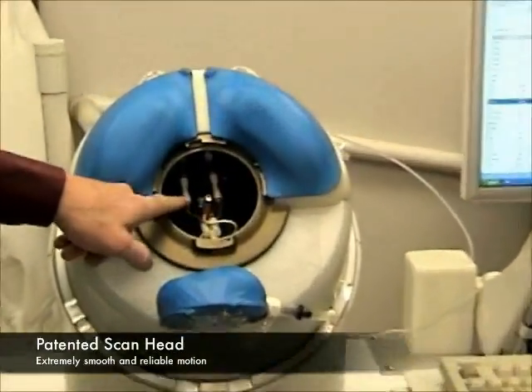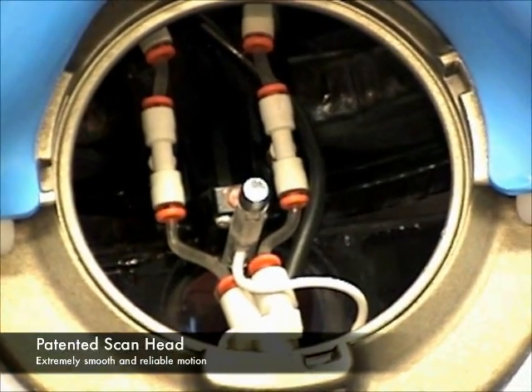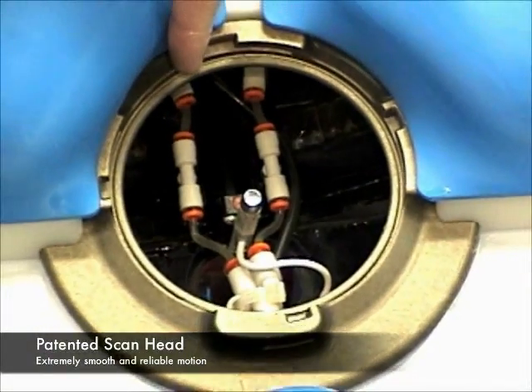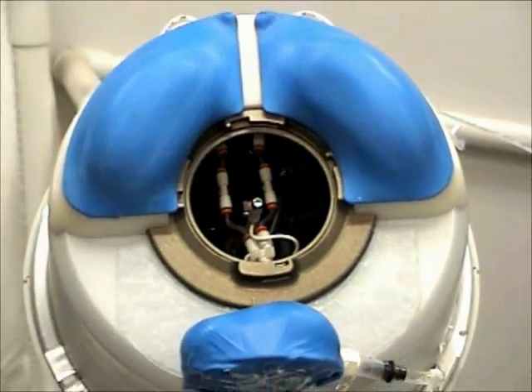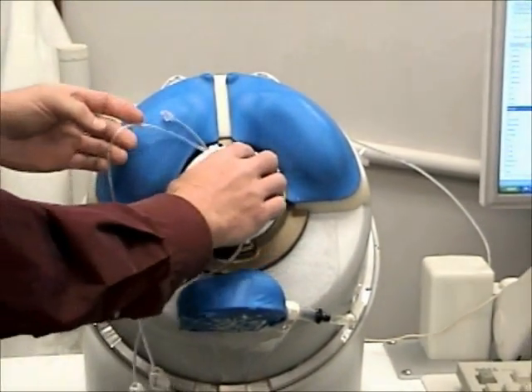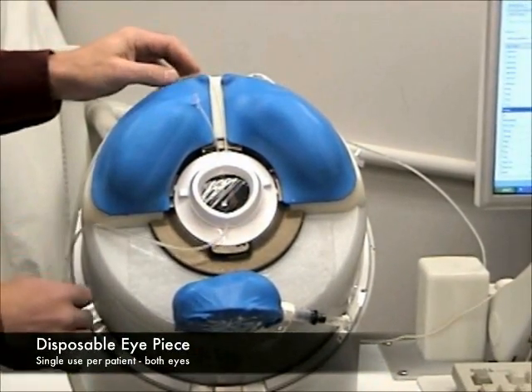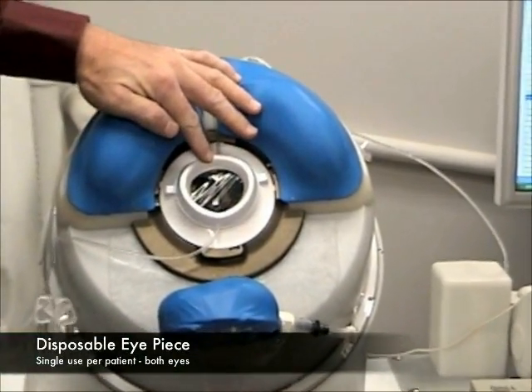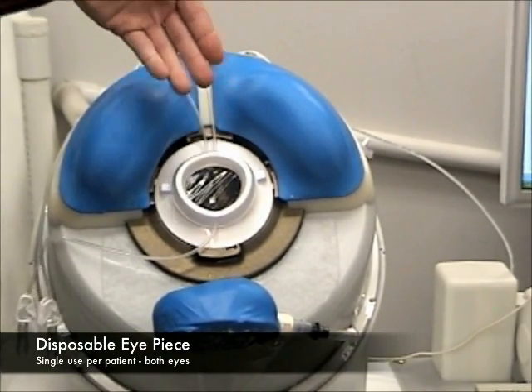We'll take a closer look at the internals of the scan head. The entire scan head chamber is filled with water. The transducer is mounted on an arc motor that moves back and forth to keep the transducer perpendicular to the eye during scanning. The disposable eyepiece mounts to the scan head. The eyepiece contains a membrane that provides a separation barrier between the water in the scan head and the sterile saline that contacts the patient.